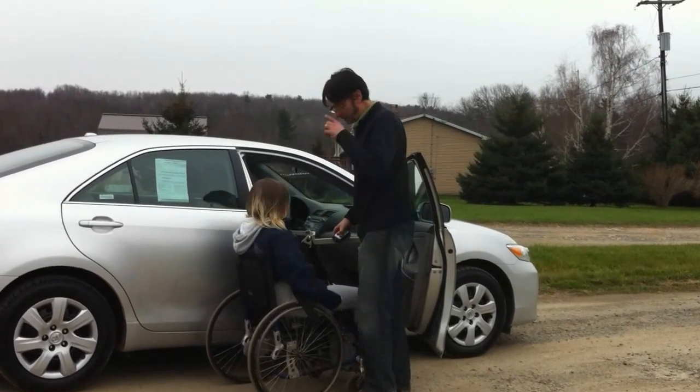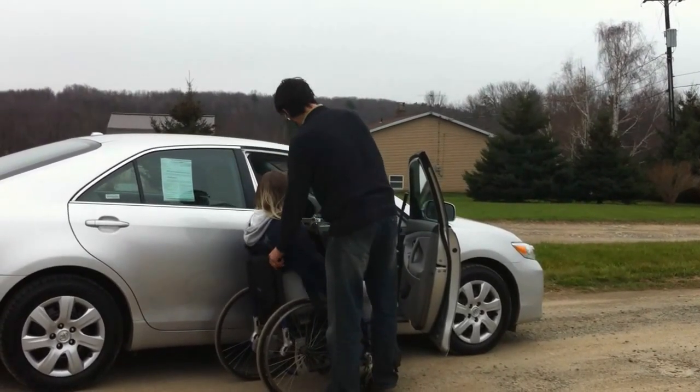Once the user is raised up, we're going to move the wheelchair lift out of the way.